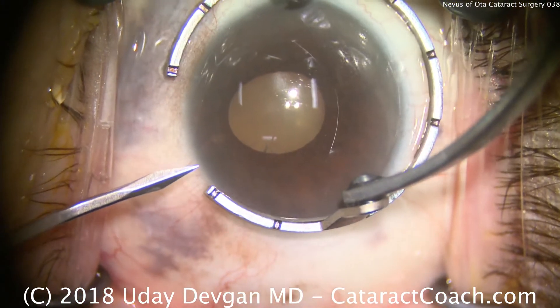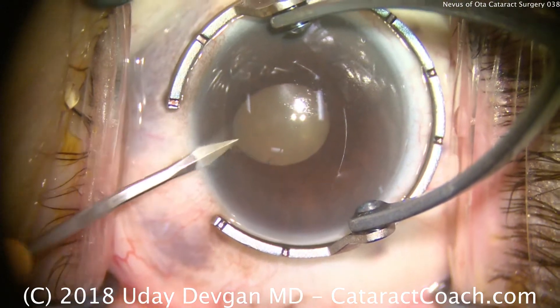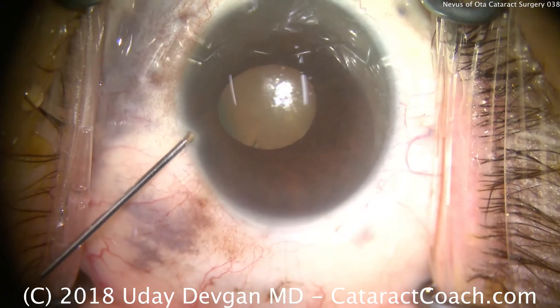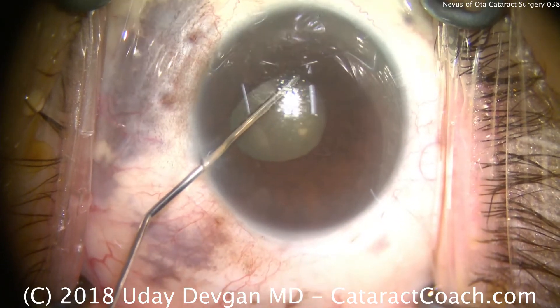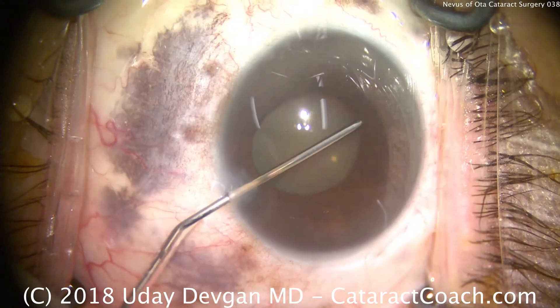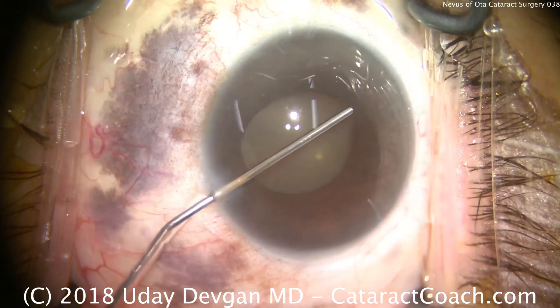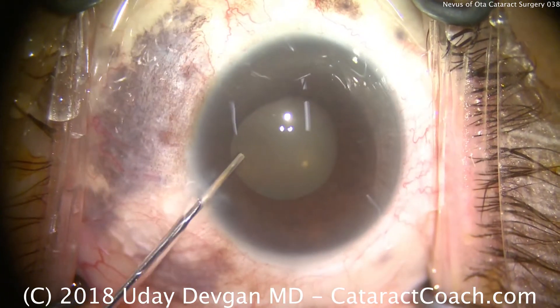We'll make our paracentesis, and the first thing we notice is that the pupil dilation is a little asymmetric — it's a little smaller than we wanted. So we'll instill some anesthetic plus epinephrine mixture underneath the iris in all quadrants. This is a solution with 1:10,000 epinephrine, along with 1% preservative-free lidocaine, all in balanced salt solution.